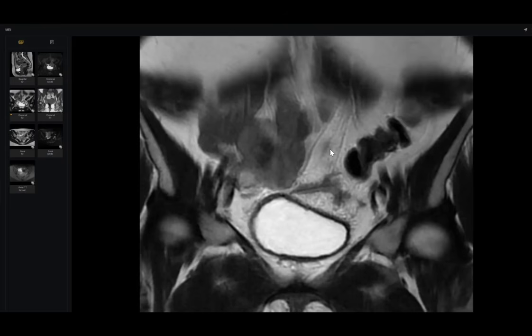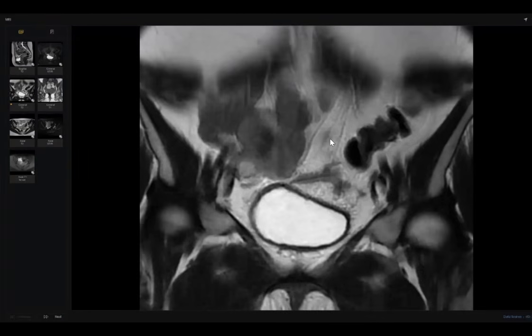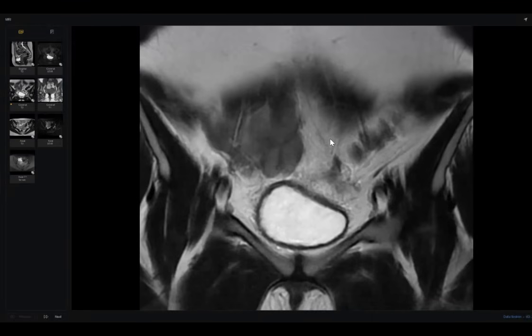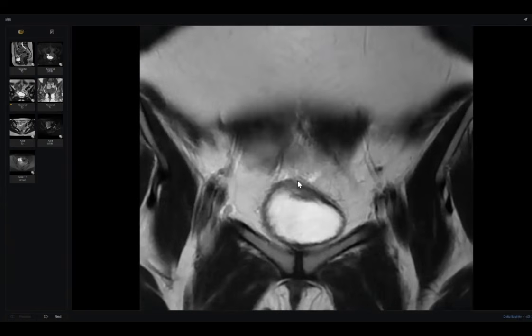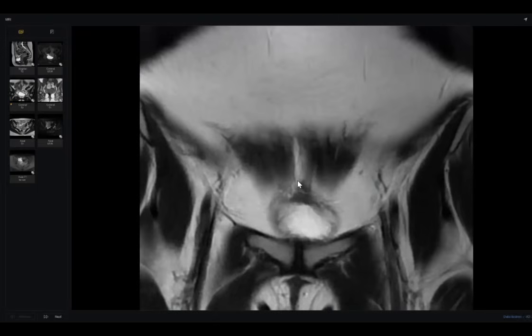Number two, in MRI, we have a very big problem. Calcification and foreign bodies are very hard to detect. At least you can say, Doctor, I see here a dark linear signal. I don't know what this is. It may be a foreign body, maybe something else. I would want to revise all the images, X-ray or CT.